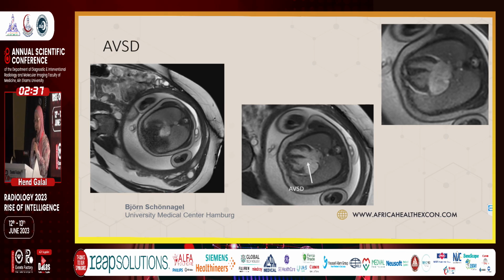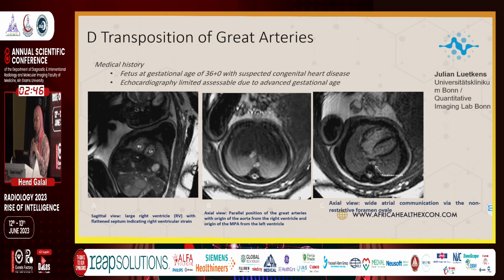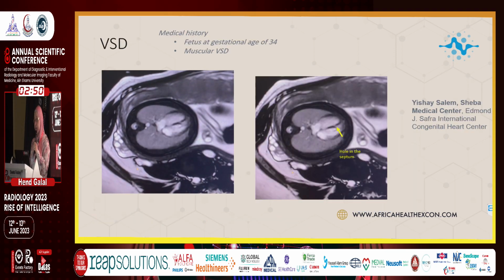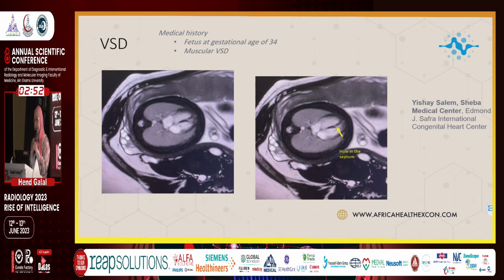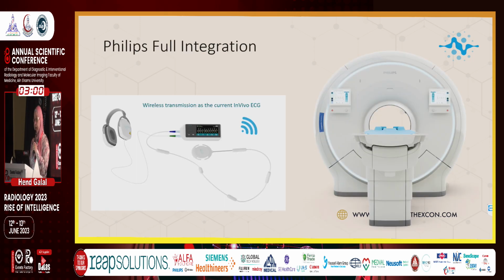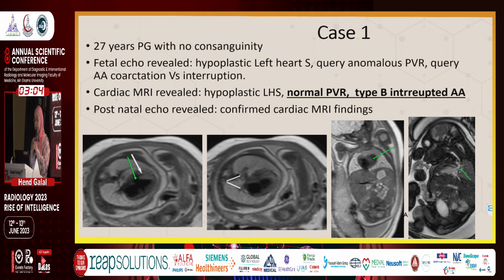AVSD, diaphragmatic hernia, transposition of great arteries, types of VSDs and their numbers and sizes, exactly like we do with an adult. And this software and hardware have MRI integration with all types of machines, either fully integrated or with wireless integration.